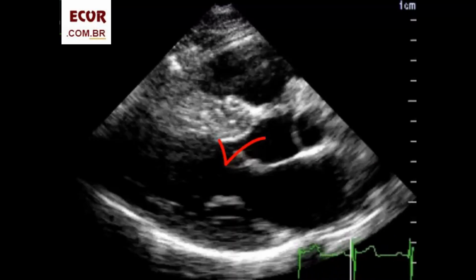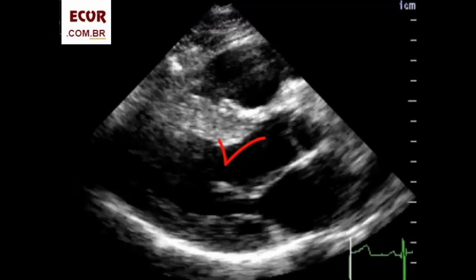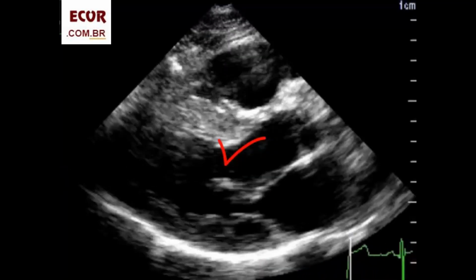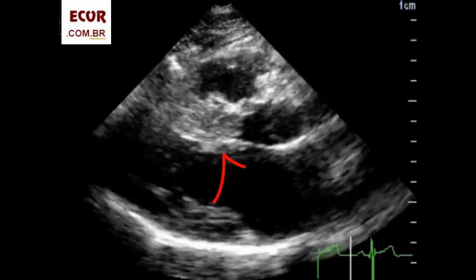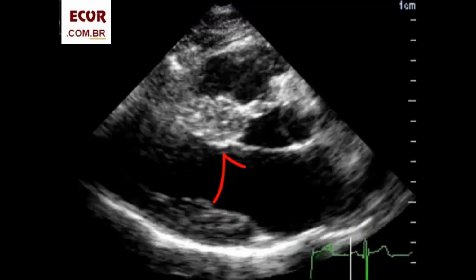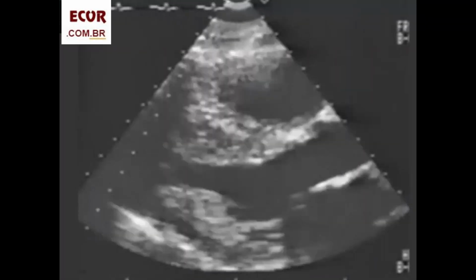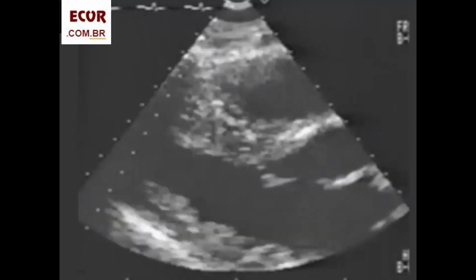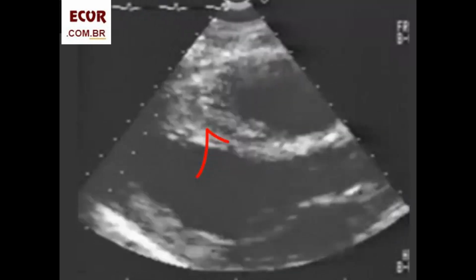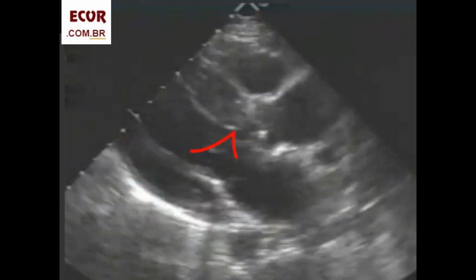The region of the mitral valve that seems to be cords and not the anterior leaflet are projected to the left ventricular outflow tract. Look at this more echogenic area at the endocardium of the IVS, right where the cords touch the IVS. In this case, the hypertrophy is not as evident in the immediate subaortic region, but at mid-septum.